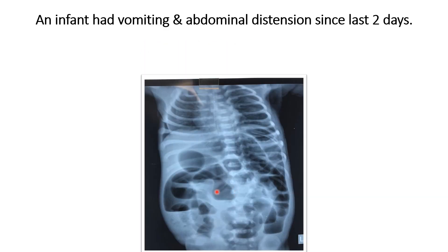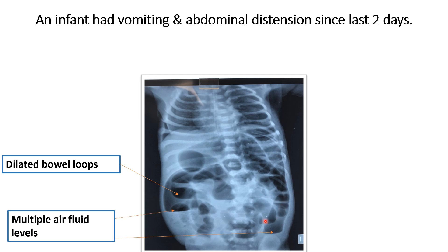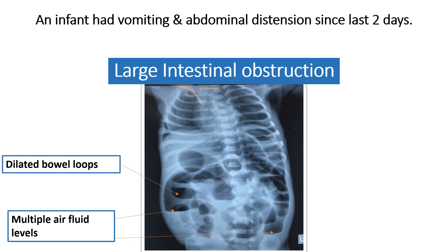In this X-ray, you can see characteristic air-fluid levels present throughout the abdomen. This is the X-ray of an infant who had vomiting and gross abdominal distension since the last two days. The abnormal radiological finding is dilated bowel loops — this is the ascending colon, this is the transverse colon, and this is the descending colon — with multiple air-fluid levels present throughout the abdomen. The diagnosis for this X-ray is large intestinal obstruction.